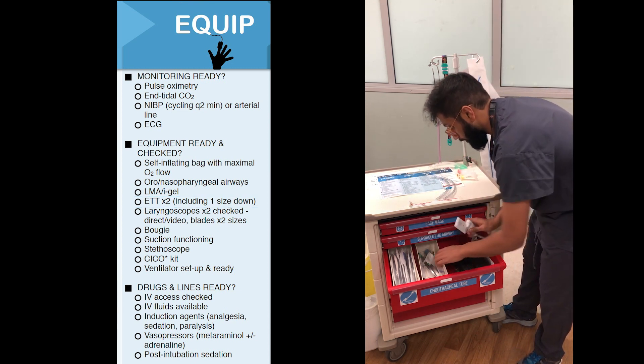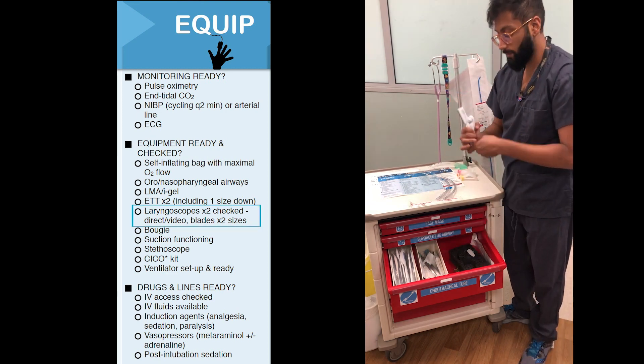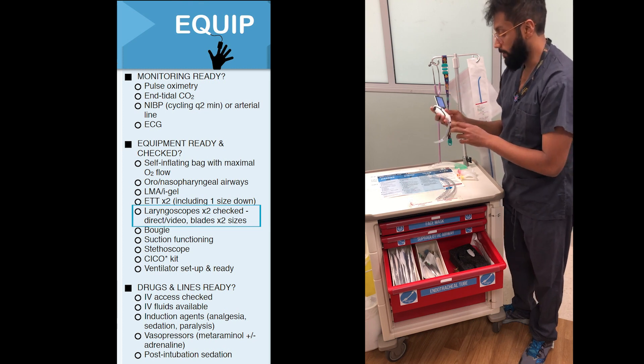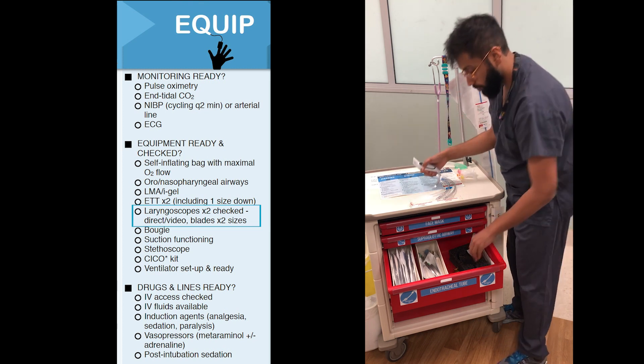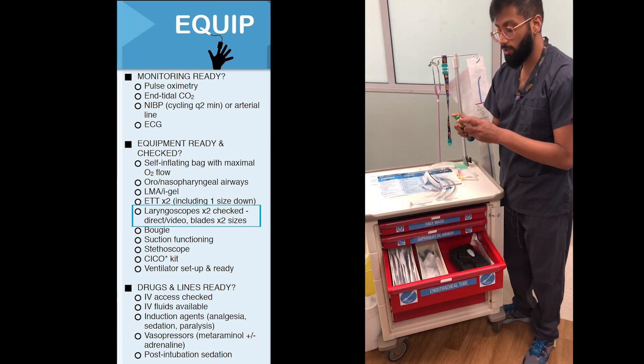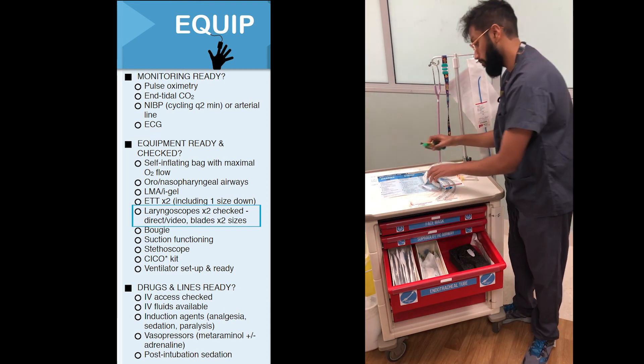To pass the tube we'll need a laryngoscope, and we'll need two different types here. We've got one laryngoscope called a videoscope, which has a blade attached. We'll also need a secondary laryngoscope. This one has no video, so we call this a direct laryngoscope.